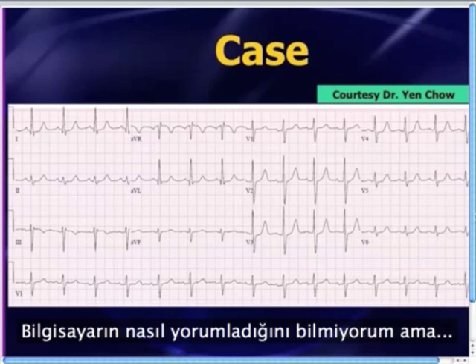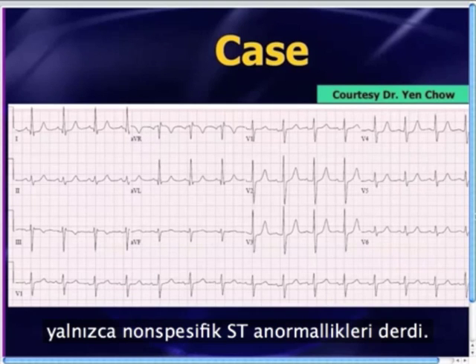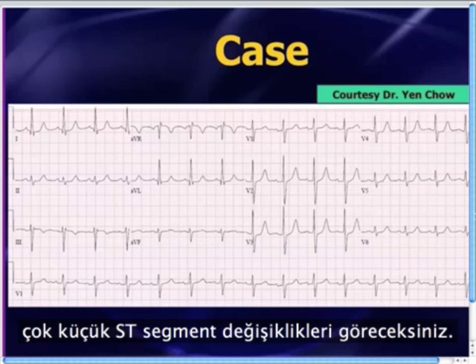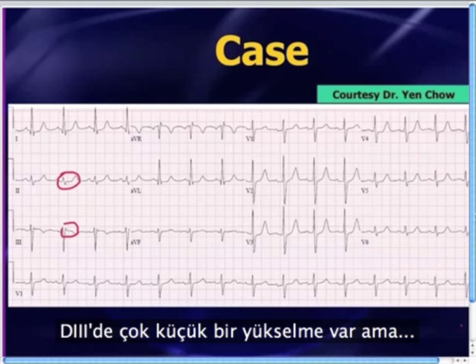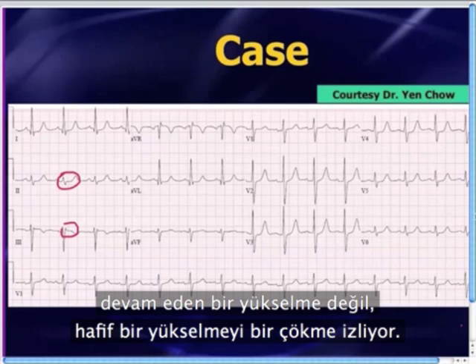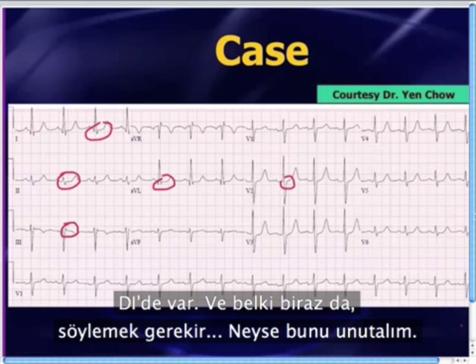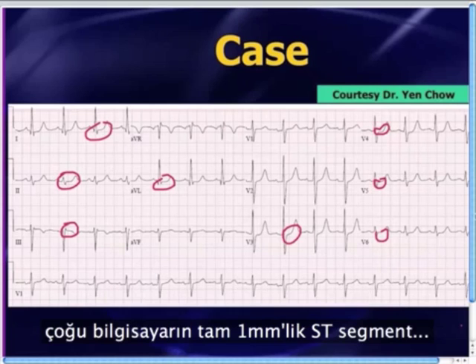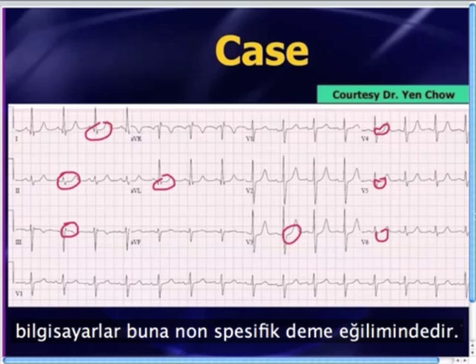The computer would probably call this just nonspecific ST abnormalities. Most computers would call it that because if you look at all of these leads, there's some very minor ST segment changes. In lead 2, they'd probably call it nonspecific — just a little bit of elevation in lead 3, but it's not elevation in contiguous leads. There's a little depression in lead 2, maybe a little in AVL and lead 1, and at least a little depression in V3, V4, V5, and V6. Computers are programmed to only read a full millimeter of ST segment change as significant.